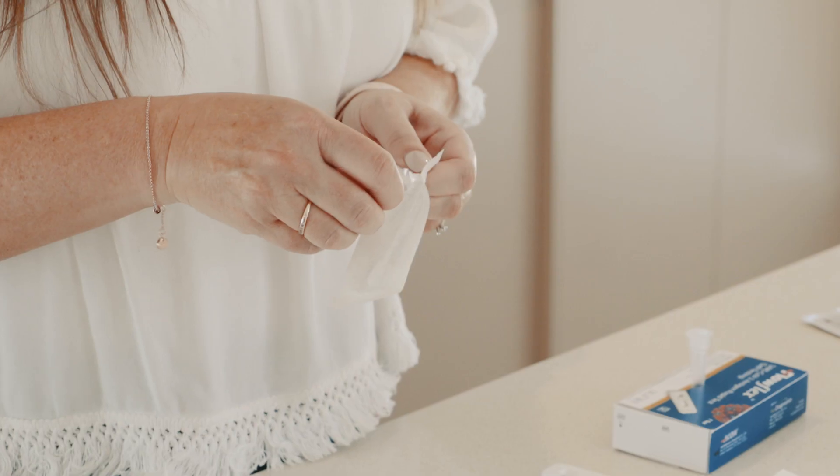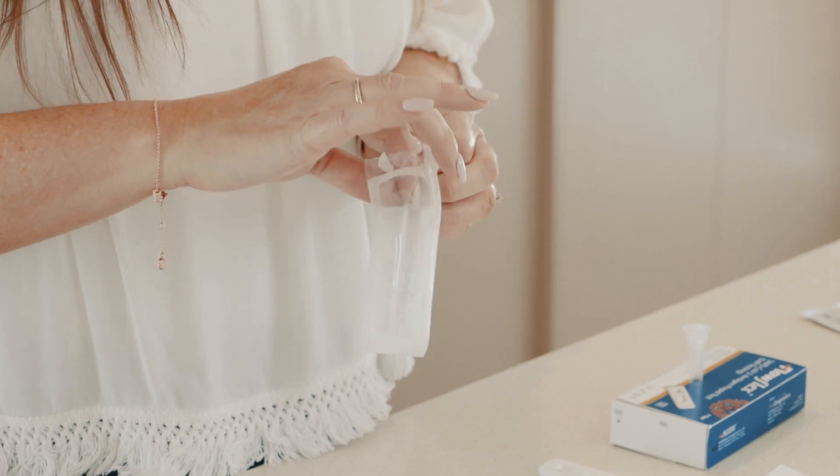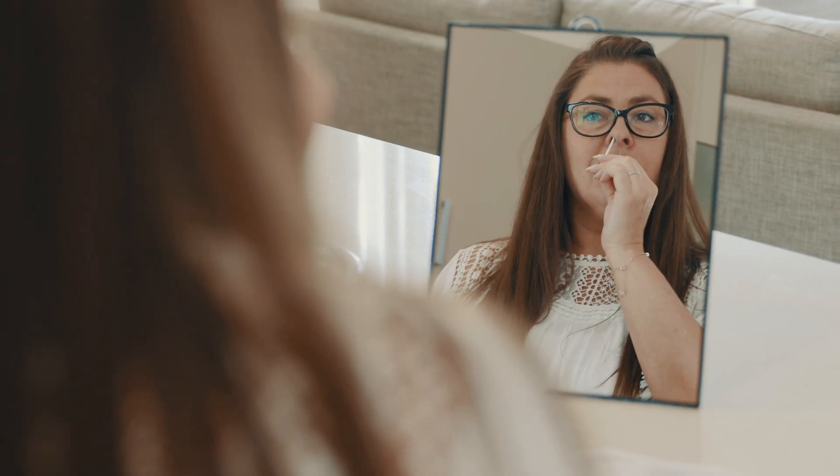Open the swab packaging, taking care not to touch the tip of the swab. Carefully insert the swab about two and a half centimetres into the nostril. Rotate the swab five times, brushing against the inside of the nostril. Repeat for the other nostril.